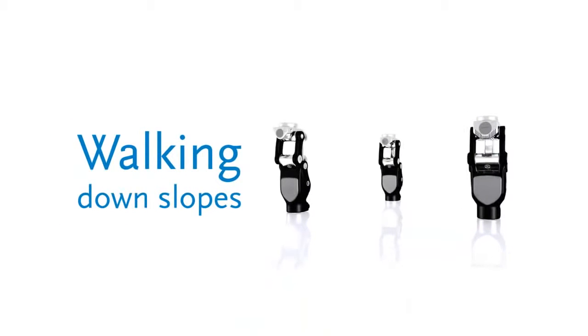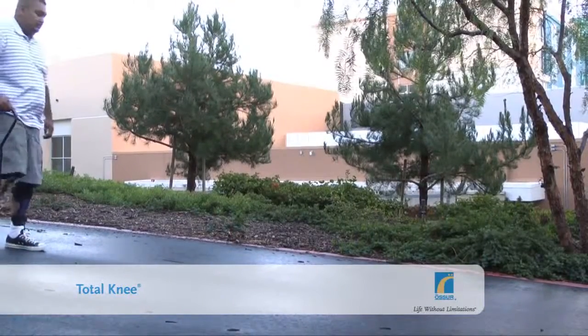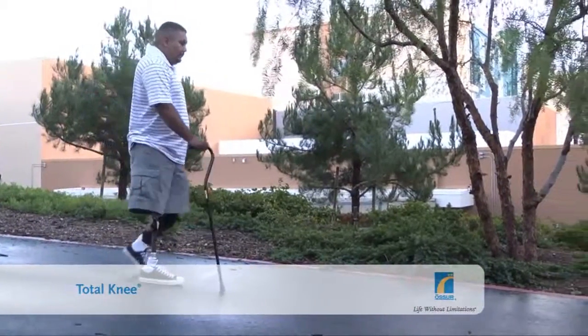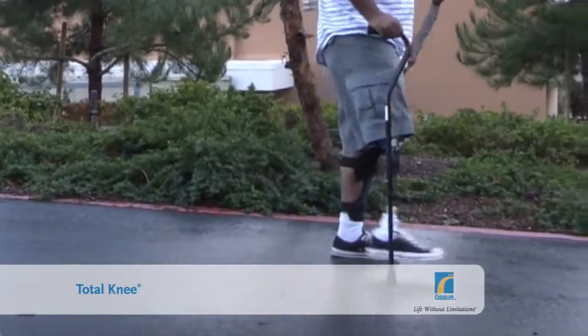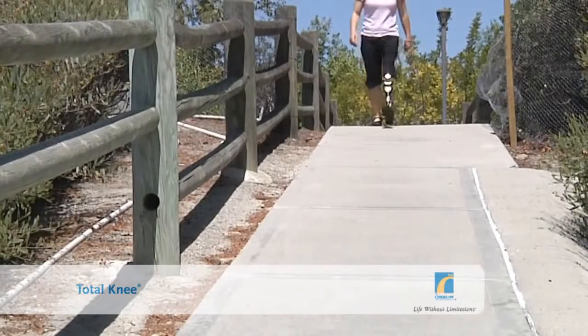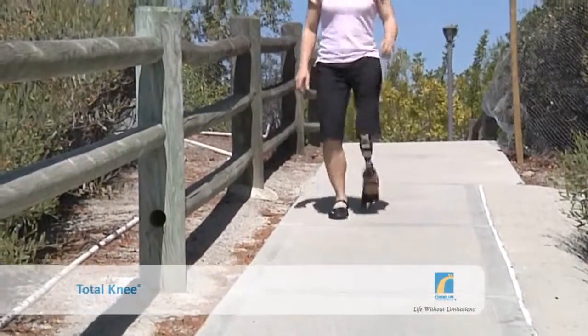Walking down slopes. Take the first step onto the slope with your prosthesis. Transfer your weight onto the heel of the prosthetic foot. Allow your body to progress steadily forward over the entire foot. As your weight approaches the ball of the prosthetic foot, the locking mechanism will release and the knee will bend.